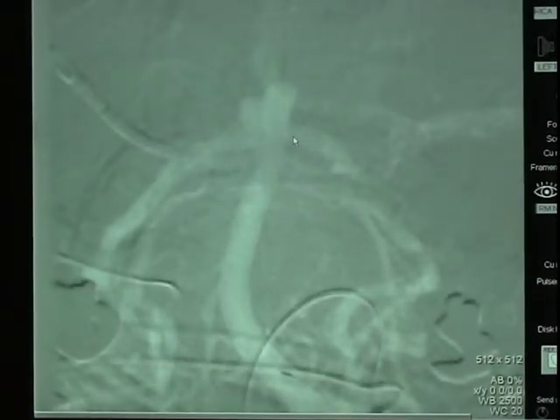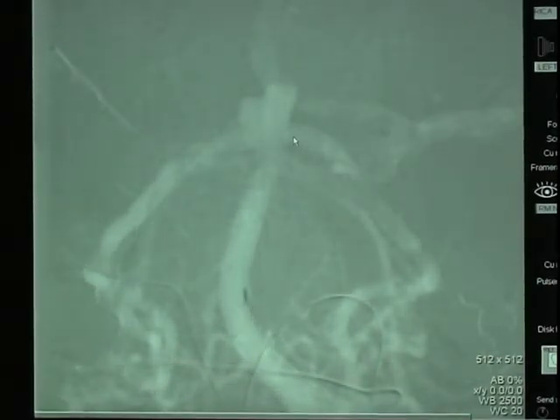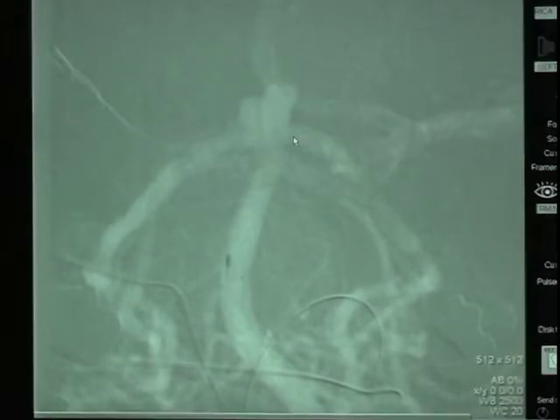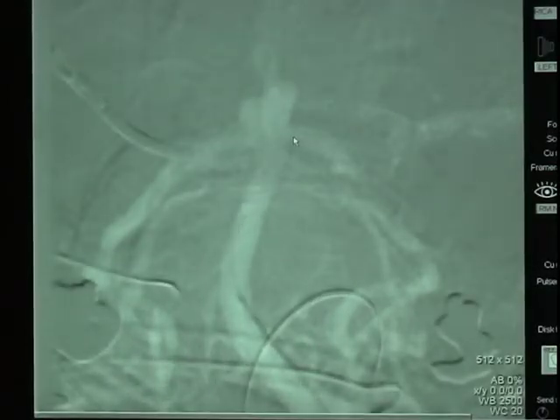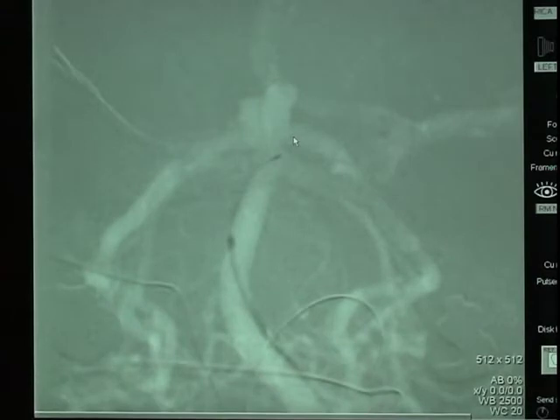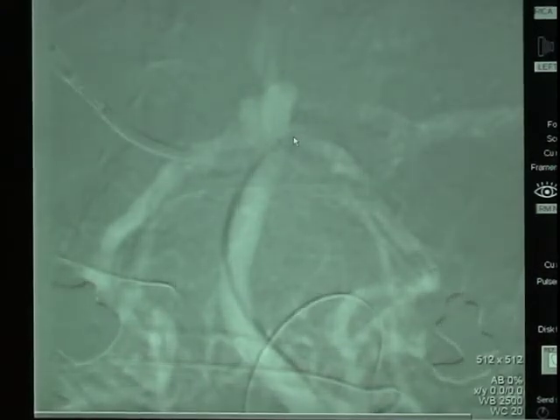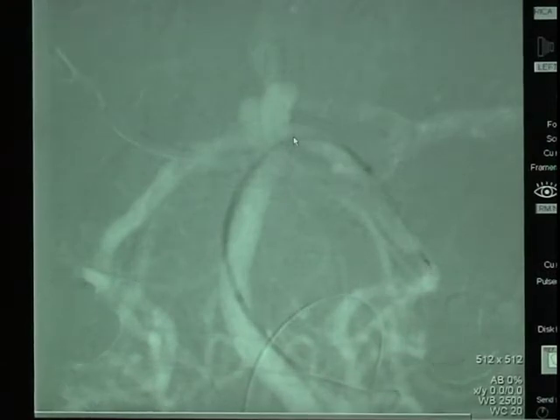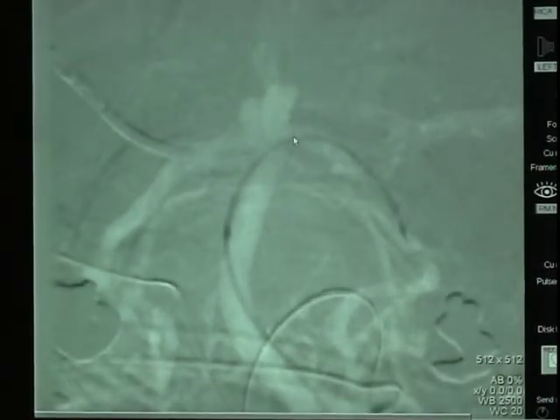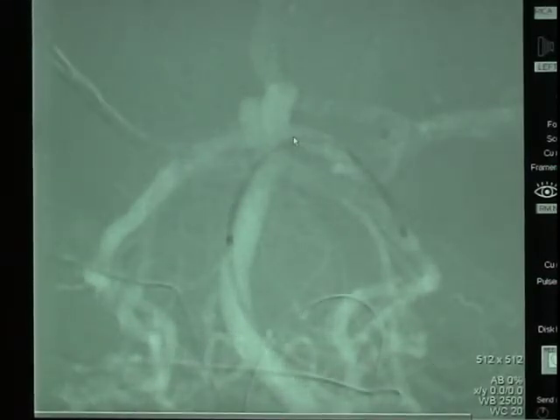This is a subtracted view. Here we see our first wire being advanced with a catheter being advanced over it into the basilar artery. This will then be advanced into the left posterior cerebral artery. The catheter is advanced and the microwire is removed.